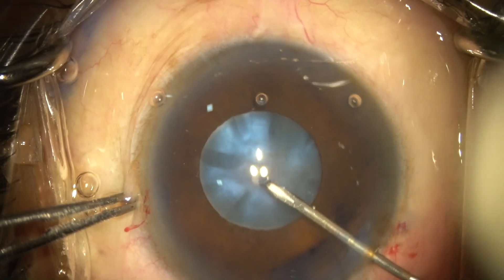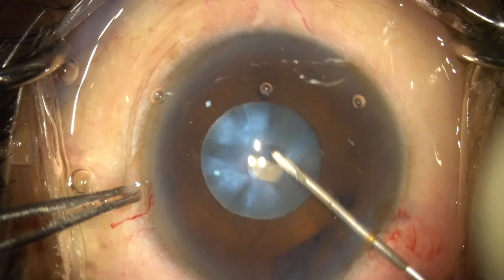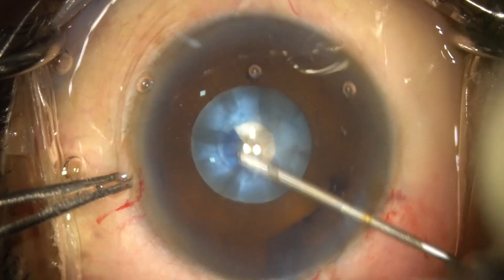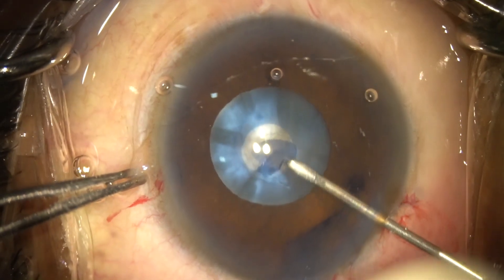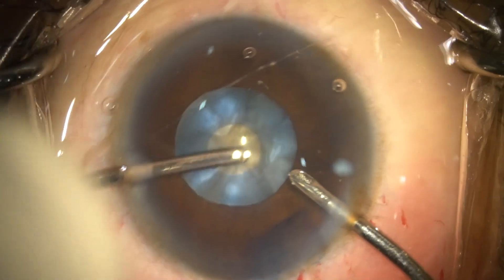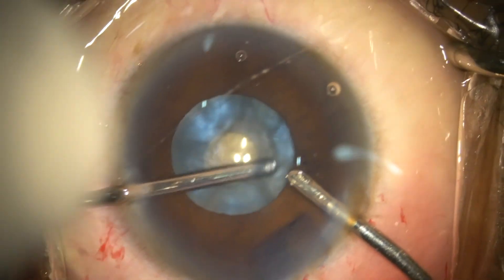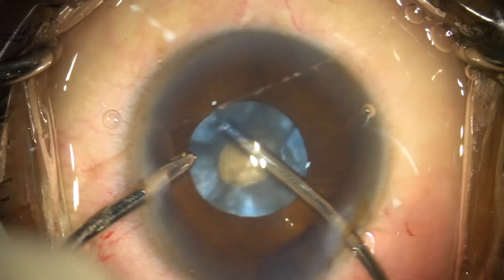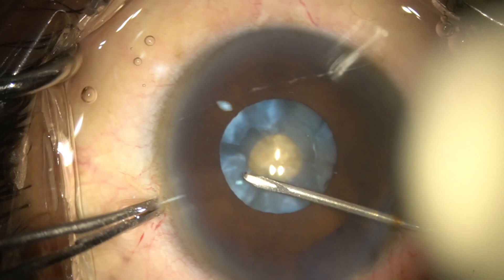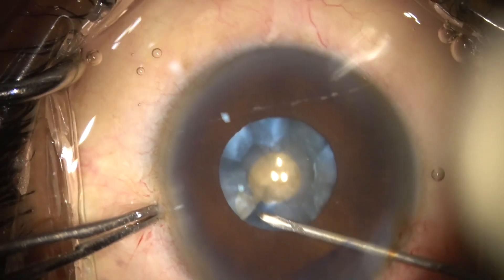This video depicts a donut rhexis in a small pupil. In this scenario, a similar 3mm rhexis is done, followed by debulking of the lens matter. The second flap is raised 1mm away from the rhexis border and completed using the cystitome.